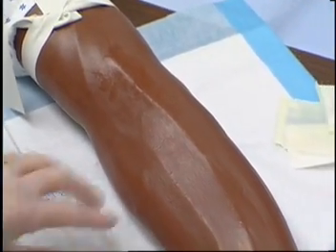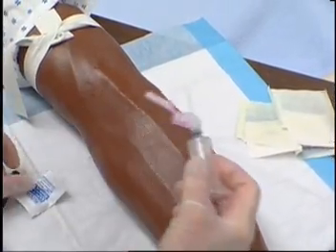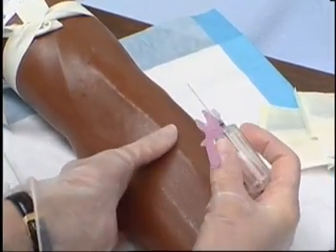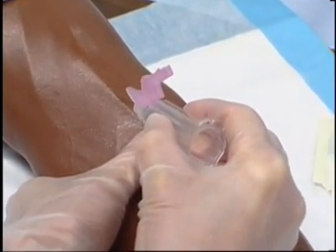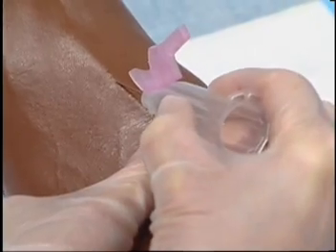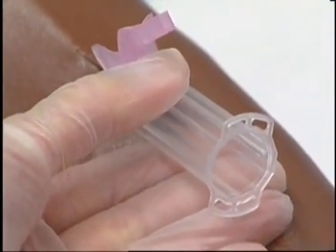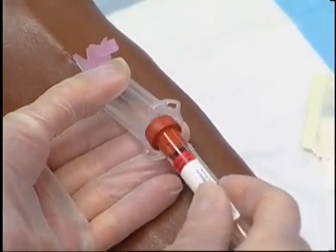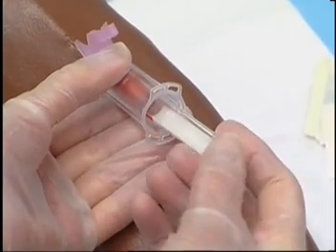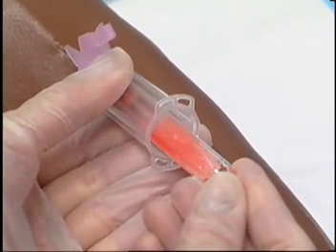With needle affixed to the vacutainer, hold skin taut with non-dominant hand. Perform a venipuncture with bevel of needle pointed up at a 30-degree angle. Lower needle slightly towards skin after needle enters vein and stabilize with non-dominant hand. Insert blood collection tube while holding plastic adapter steady. Press vacuum tube firmly into short needle so that it pierces top of tube.